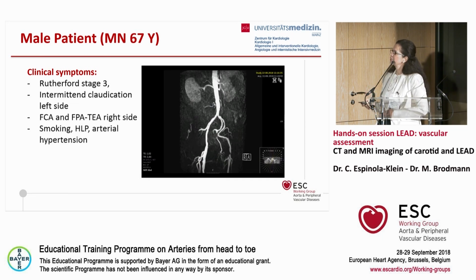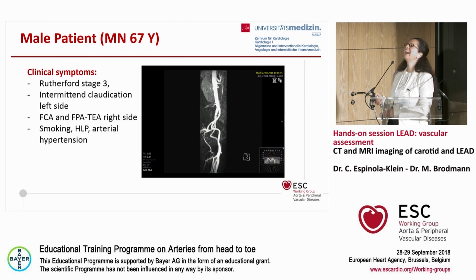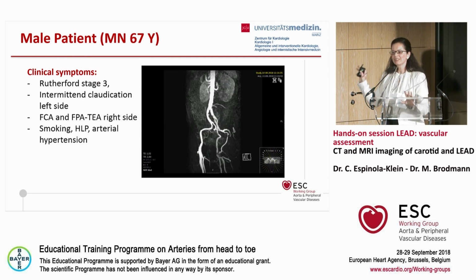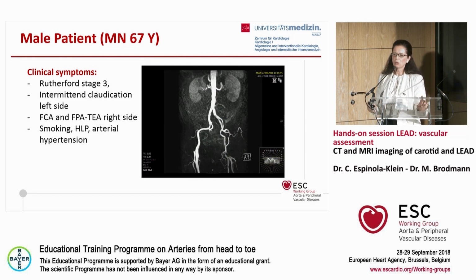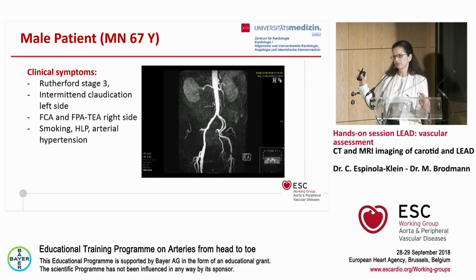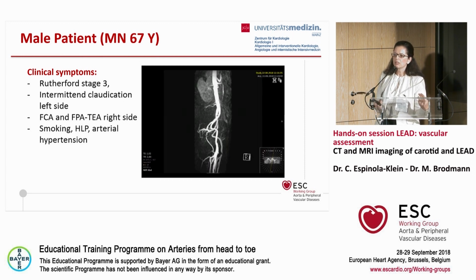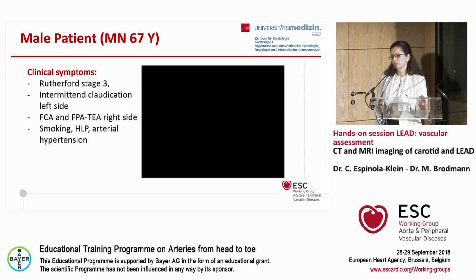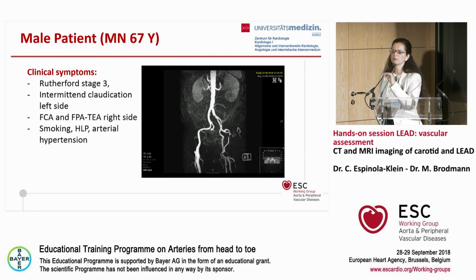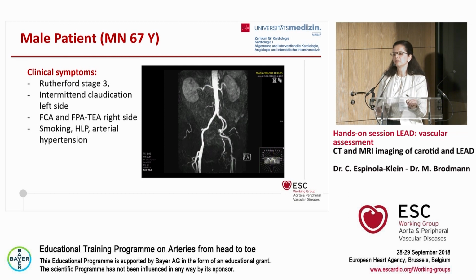So the next patient. Sorry, what have you done in the end? The patient will come again. We have not done anything at the moment. We decided that the patient comes back to us to talk about the discussion in the board and about the images, and we will discuss with him conservative treatment versus surgical approach. That was the final decision. We did not treat him yet. It was 2 weeks ago, the MRI scan.